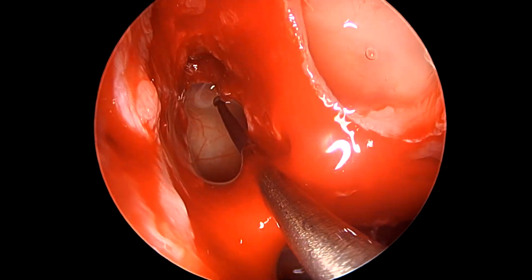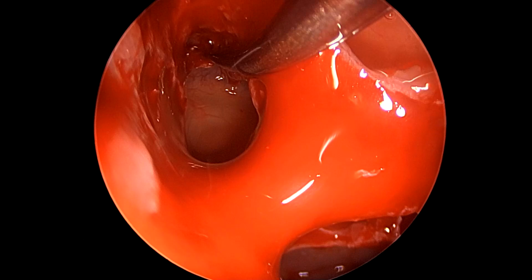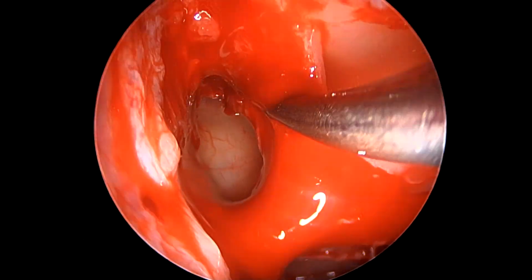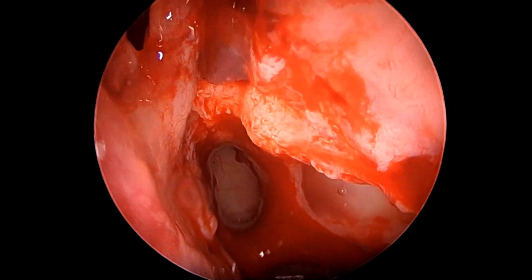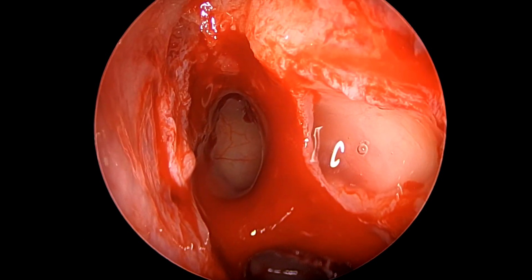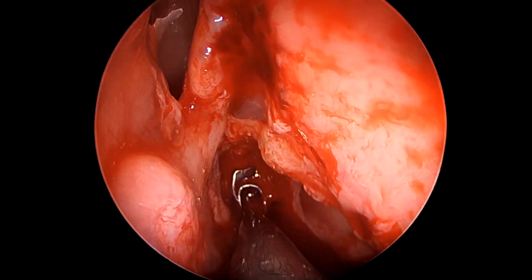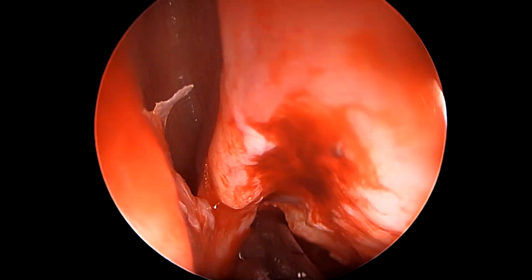It's quite remarkable how clear one's understanding of the CT scan must be. And as you see here now, our instrument with the angled endoscope is able to negotiate the space between the frontal beak and the anterior wall of the suprabullar cell to conclusively open the frontal sinus proper.